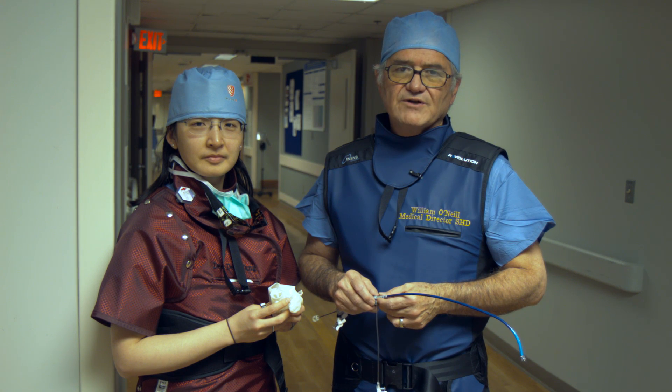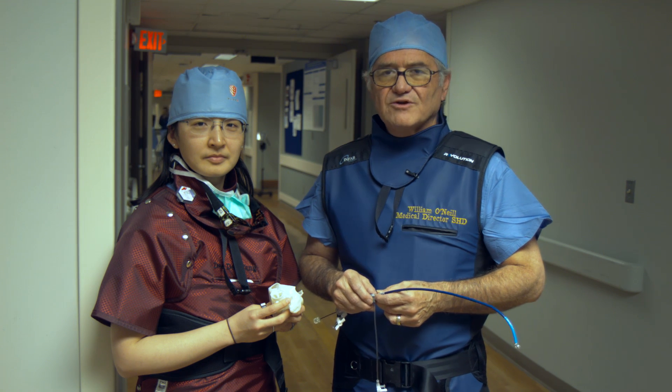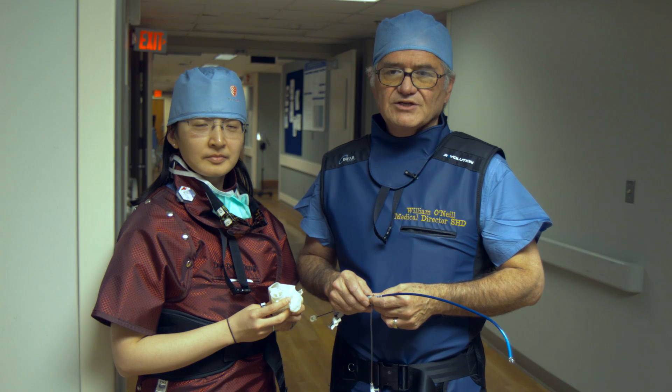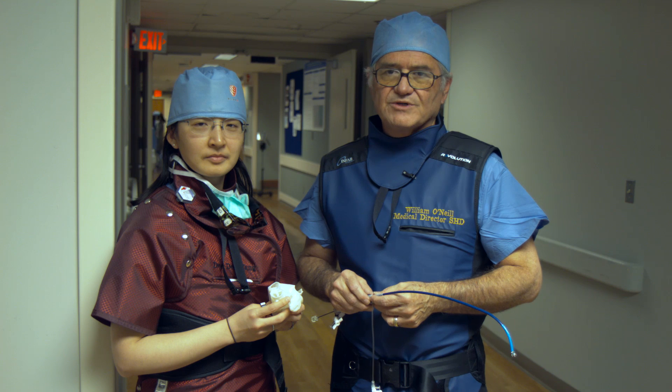We found a wonderful new way of being able to place the device in a very safe and effective manner. With me is Dr. Didi Wang, who is the head of our structural imaging program, and she's going to tell you how we plan and perform the procedure.